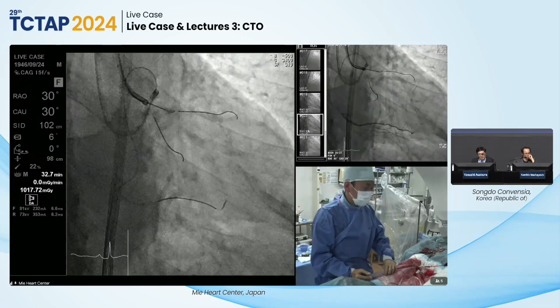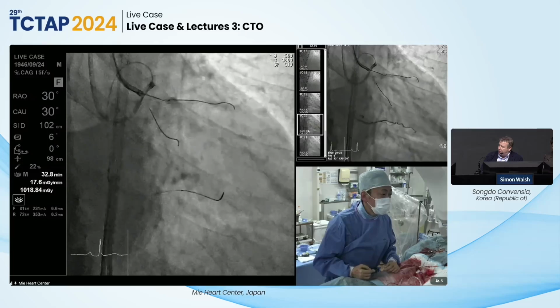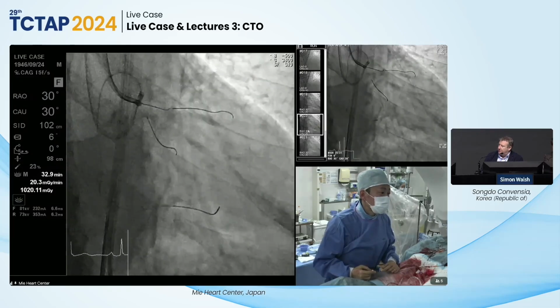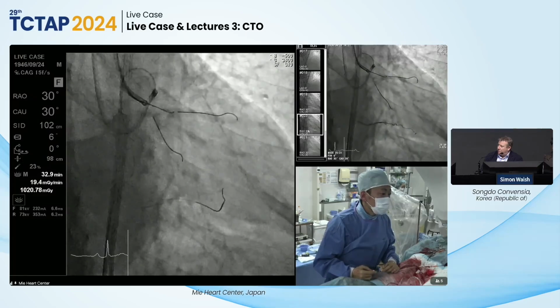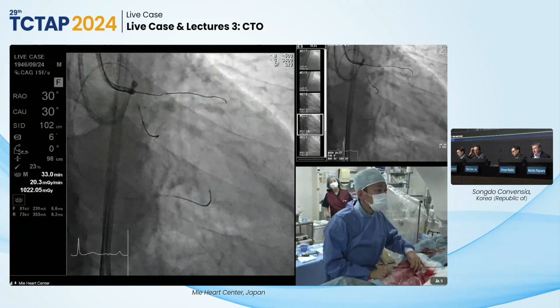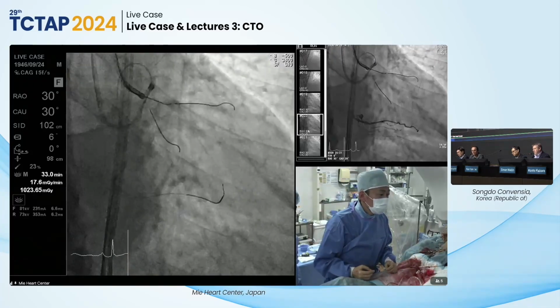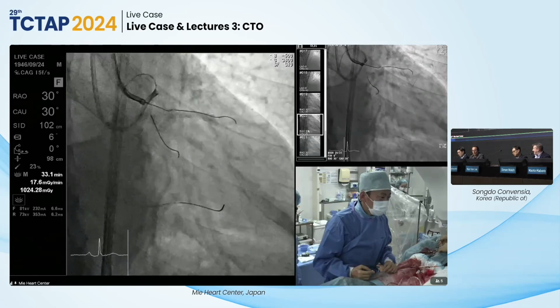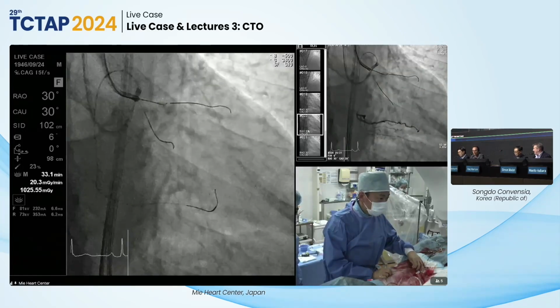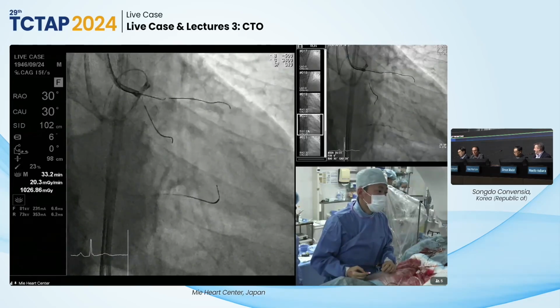A broader question, is anybody working in a hospital that has something like Rampart or EGG or the more advanced radiation protection systems? So I would like to get that from the beginning, but I couldn't explain to my administration the necessity of that because they are just counting euros and don't care how we are doing.